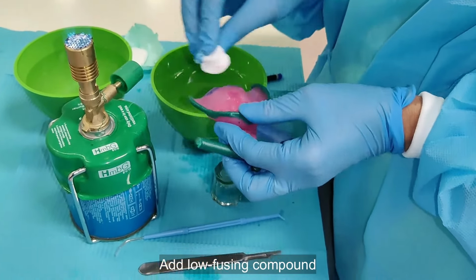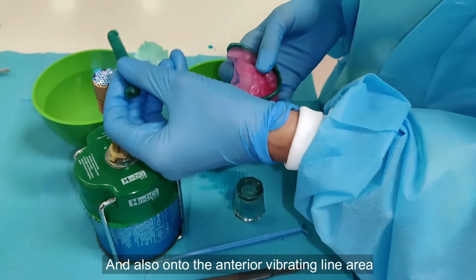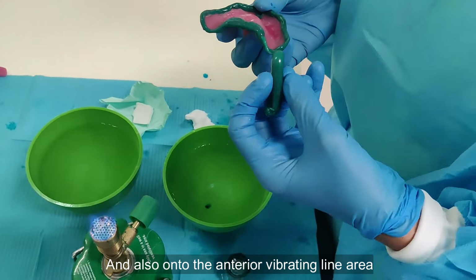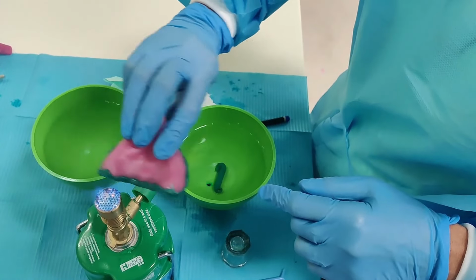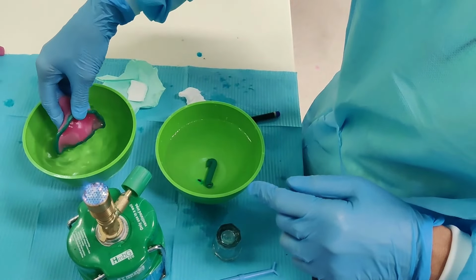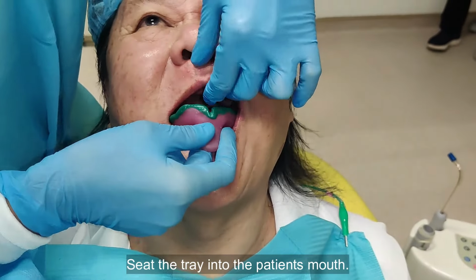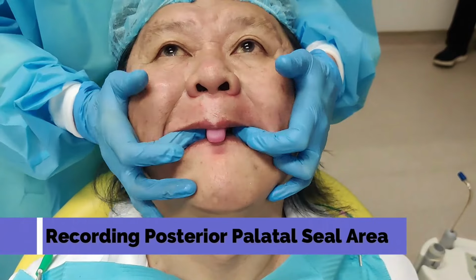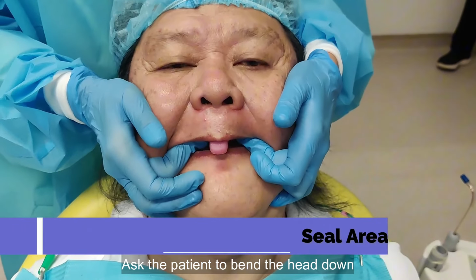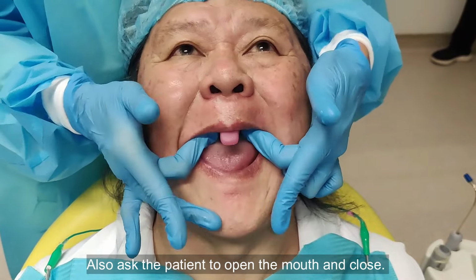Add low fusing compound to the posterior border of the special tray and also onto the anterior vibrating line area which we have transferred from the mouth. Seat the tray into the patient's mouth. Ask the patient to bend the head down and say "ha." Also ask the patient to open the mouth and close.